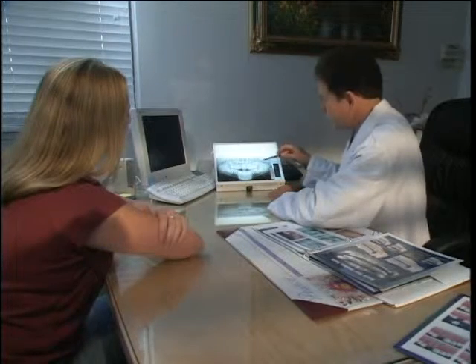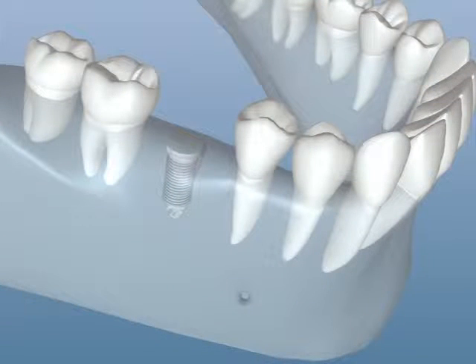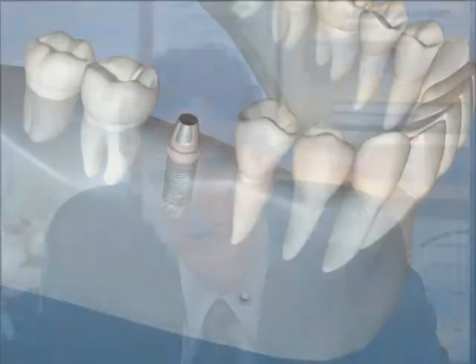Now, several months after the initial surgery, when the implants are securely joined to the bone, we conduct the second procedure. During this second procedure, an incision is made in the gum to uncover the top of the implant, and a healing post is attached. The healing post protrudes from the gum, which requires some adjustment of the denture or the bridge that rests on top of it. And the patient's dentist will adjust the dental appliance to accommodate the post during the healing period.